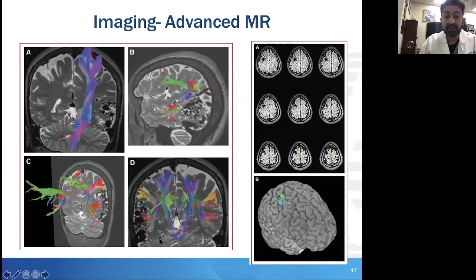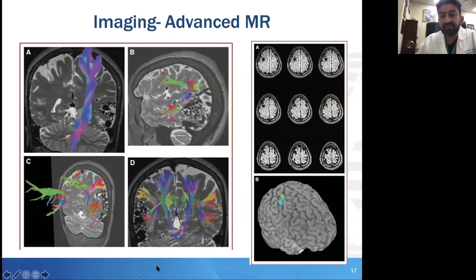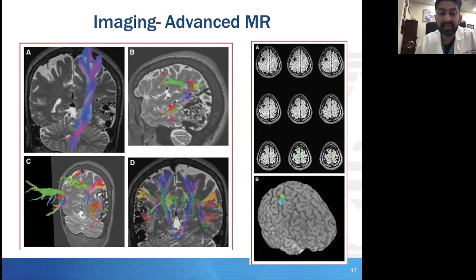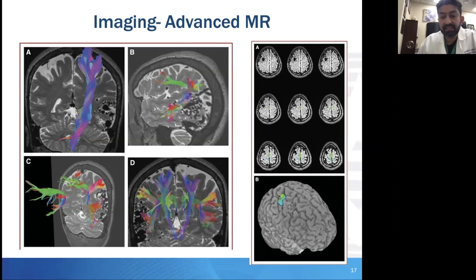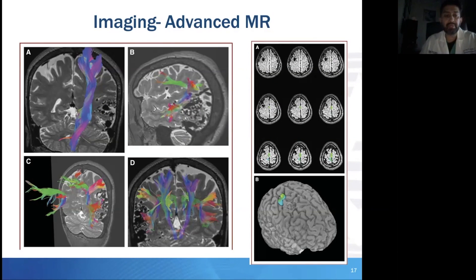The other thing that has become more and more mainstay over the last 10 to 15 years is advanced MR imaging. Some examples here on the left with this sizable left occipital temporal AVM include diffusion tensor imaging and fiber track mapping — very nice delineation of some very critical neural fibers relative to the AVM. We utilize this almost routinely now for surgical planning of these lesions and better understanding potential morbidity for patients.